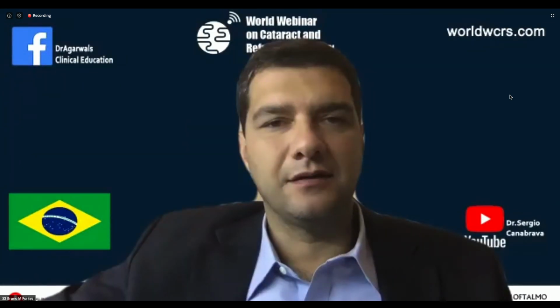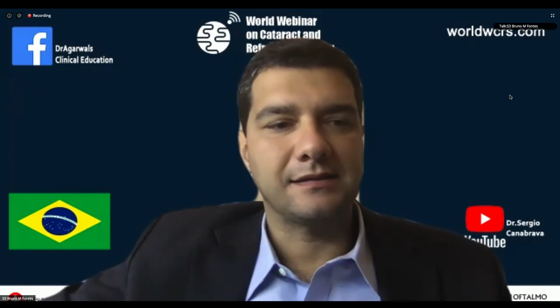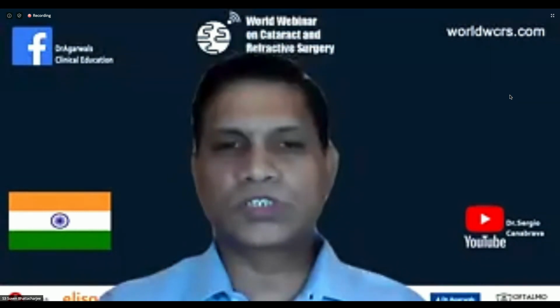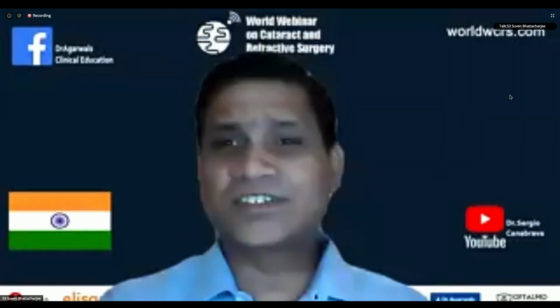We have some questions regarding if the B-HEX is reusable? Well, it's officially sold as a single-use disposable device, and it costs a lot less than Boris's ring.